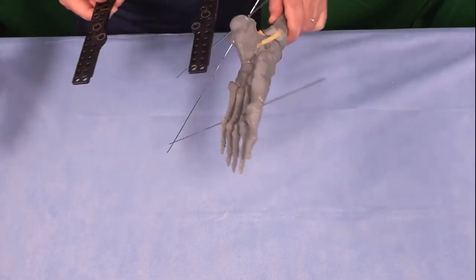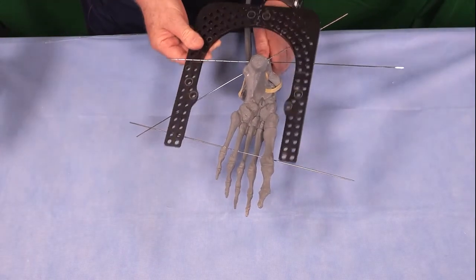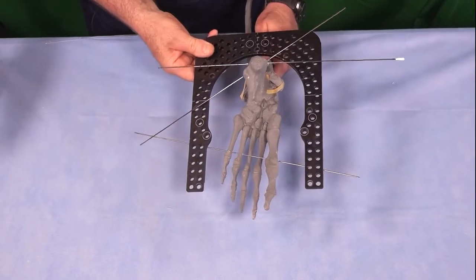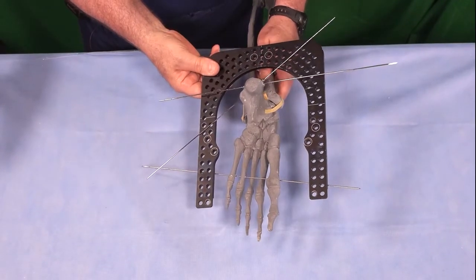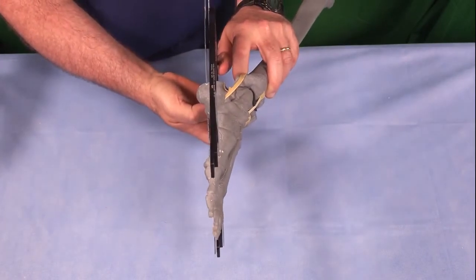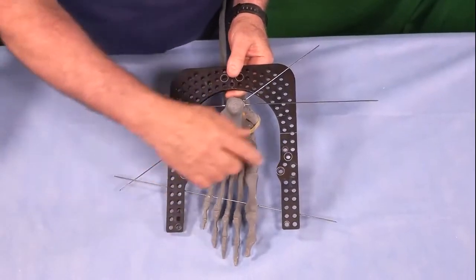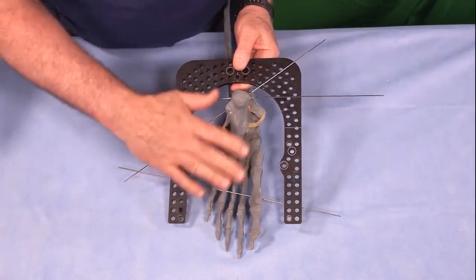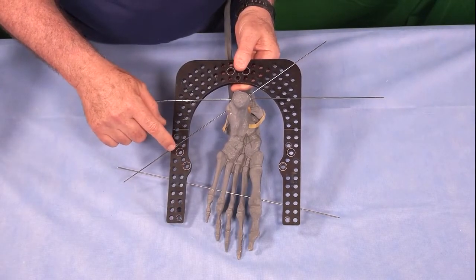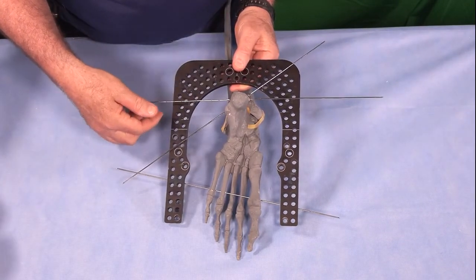So with my rings in slightly different planes, I can try to find what is the best pathway by sliding it above, below, through this maze of wires and see where it fits the best. That looks pretty good. And where it fits the best is where it looks parallel to the plantar surface of the foot. So I'm going to go ahead and start putting my fixation on. Basically, I want to have the ring parallel to the plantar surface of the foot and also parallel to the long axis of the foot. So this wire is resting right on the ring. I'll fix that wire first, this wire second. This one's above a little bit, so I'll add a washer and so forth.